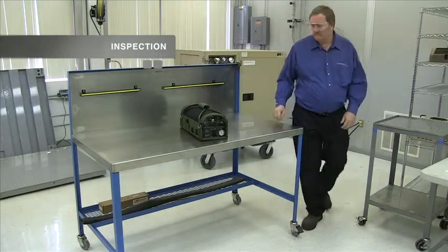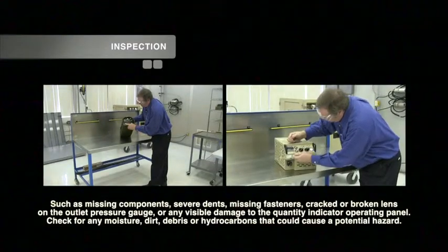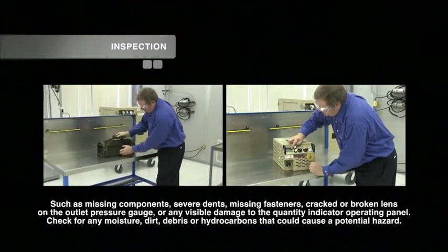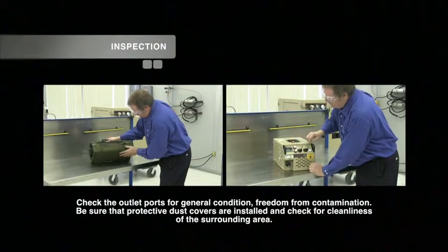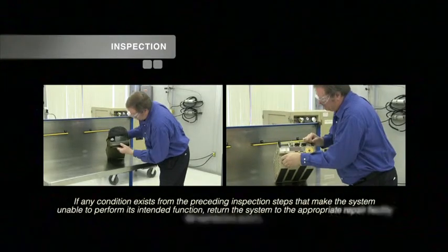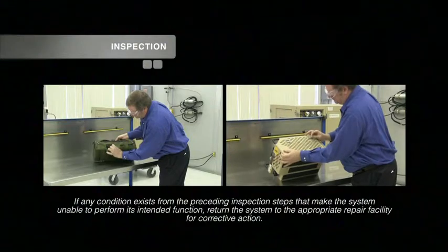It is recommended to complete a general inspection of the BMOS and M-MOS LOX converter units at least once a month. When performing general inspections, be sure to check the following: check the unit for any damage that could possibly affect system performance, such as missing components, severe dents, missing fasteners, cracked or broken lens on the outlet pressure gauge, or any visible damage to the quantity indicator operating panel. Check for any moisture, dirt, debris, or hydrocarbons that could cause a potential hazard during filling. Check the outlet ports for general condition and freedom from contamination. Be sure that the protective dust covers are installed and check for cleanliness of the surrounding area. Check the flow control valve for cleanliness and for smooth operation of the control knob through its entire setting range. If any condition exists from the preceding inspection steps that makes the system unable to perform its intended function, return the system to the appropriate repair facility for corrective action.